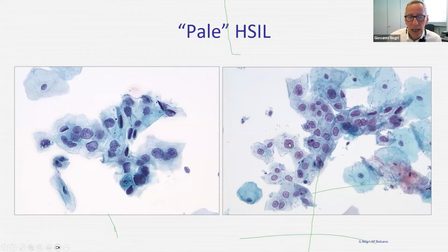see some of this. So in that case, you see a lack of hyperchromasia, of real hyperchromasia, but look at these nuclei again, very high polymorphy, very evident nuclear membrane alterations with grooves, with indentations, again in this case, so it can only be an HSIL cell.